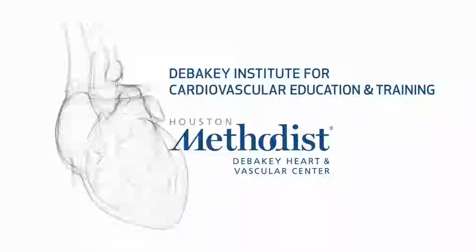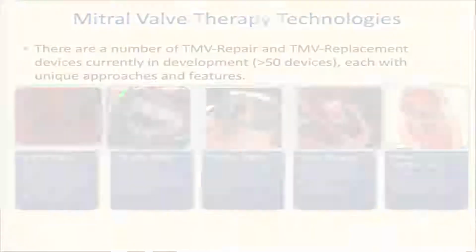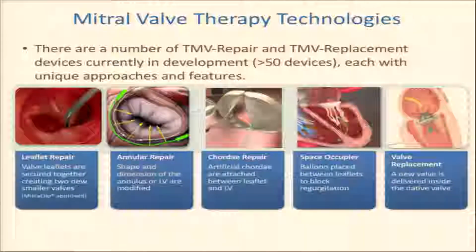So the next talk builds off of that and goes right into transcatheter therapies. And again, disclosures, and I'm going to go fast through these because I have a lot of slides, but these can be boiled down into leaflet repair. Think of the MitraClip or PASCAL, NeoChord, other things. I'm not going to talk about all of them because I don't have time to.